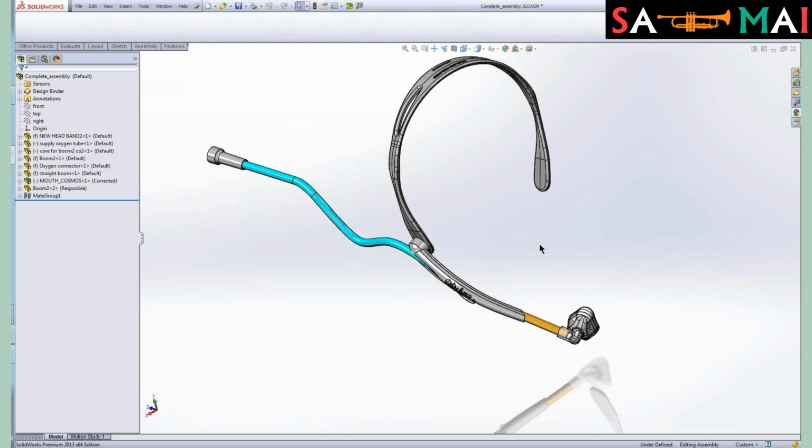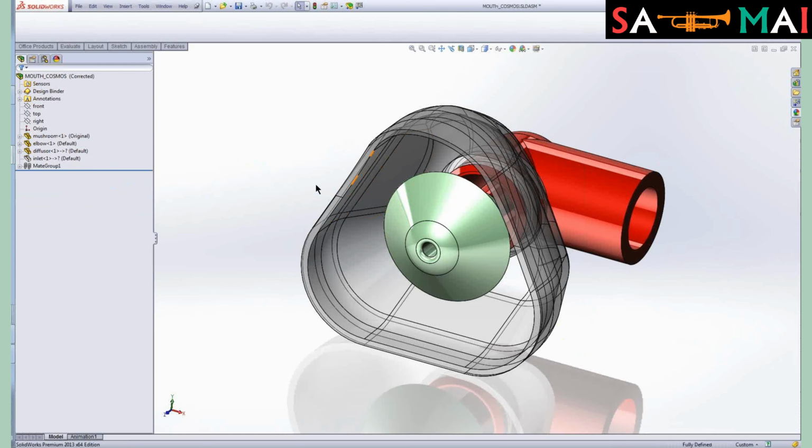This is the headset. Basically, on the back end of the part, back in here, is where we have our oxygen input. And then down here in this mouthpiece, this is where the flow of oxygen is dispersed towards the patient's mouth and nose for breathing. The components that we're really interested in, however, are just in the mouthpiece for the entire oxyarm assembly.